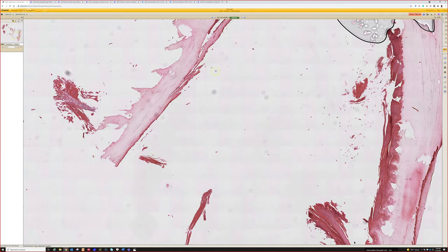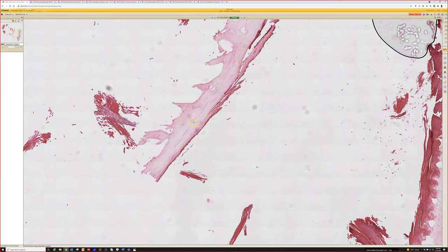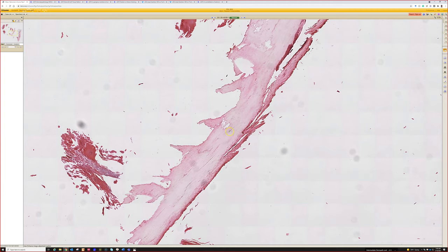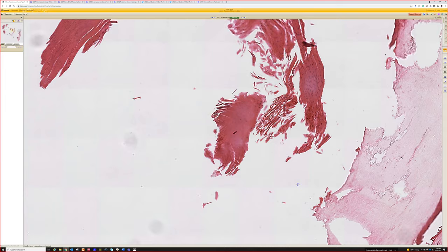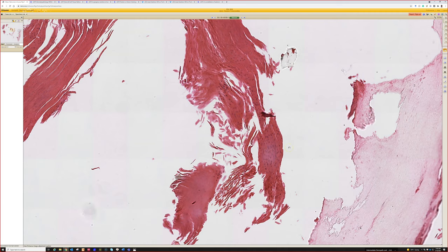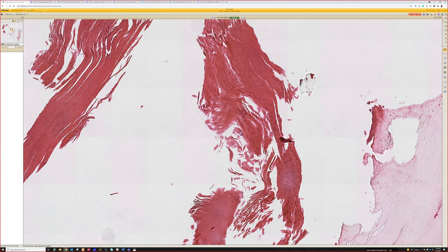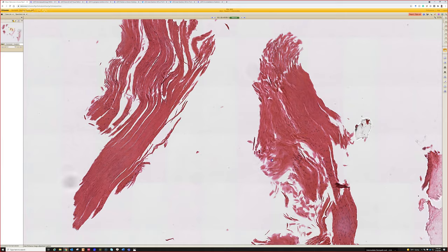It's a big, thick piece of nail plate — just compact keratin — which looks sometimes at first glance like a big thick piece of stratum corneum. It's basically a modified, super-thickened piece of the same stuff the stratum corneum is made of. The first thing we get clippings for is to rule out onychomycosis — rule out fungus. PAS or GMS stain would be negative here, so normally you could just say negative for fungus. But I'll point out there's a lot of parakeratosis, and here there are not only parakeratosis but a lot of neutrophils embedded in here.